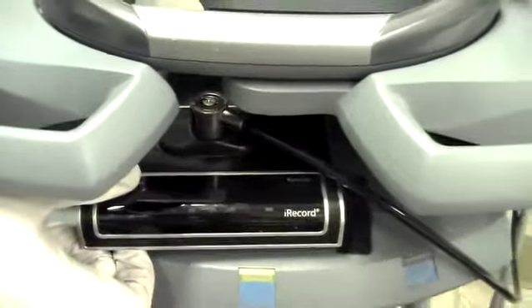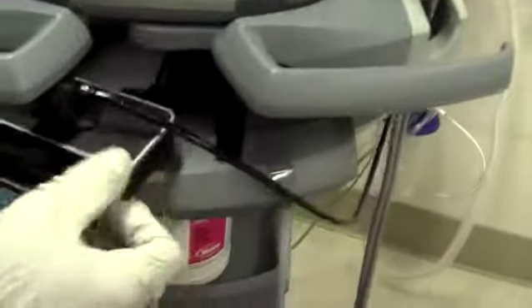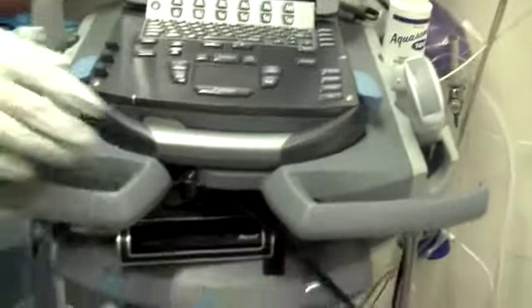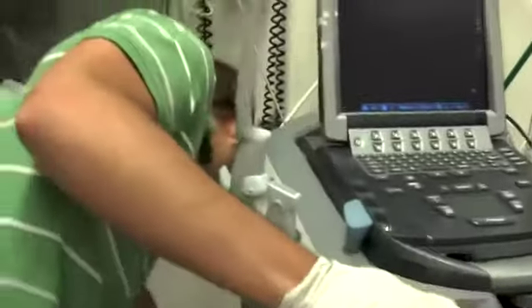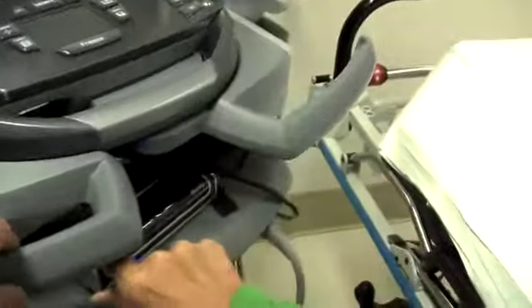Okay. Oh, this is good. We can troubleshoot right off the bat. So it's not working. So we're going to make sure everything is plugged in properly. Spin this around so we can see what you're doing. Here's the power strip down here. Everything seems to be plugged in properly, including the power strip itself. So let's try this again. You don't want to hold it too long because it'll turn off. Maybe that's what's happening. We're holding it down too long. There we go. Now we're in business.